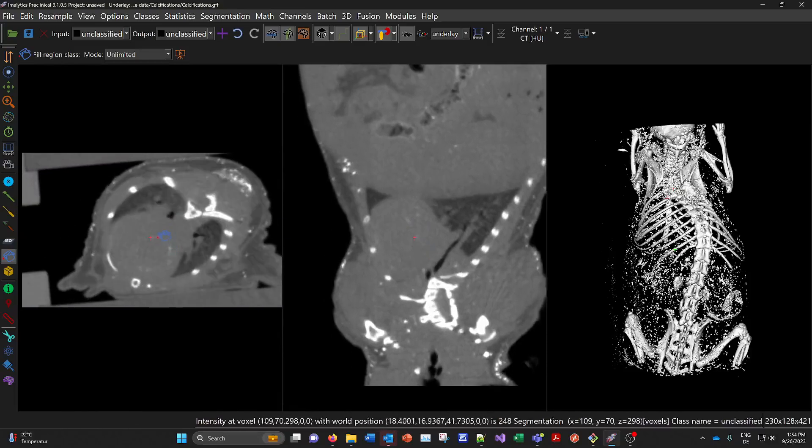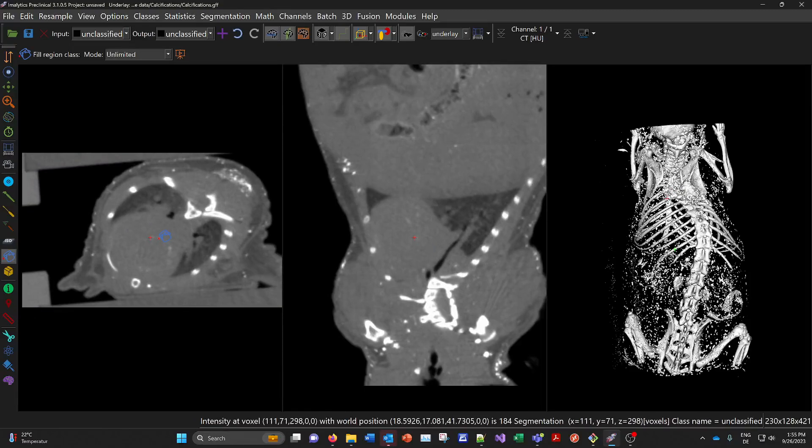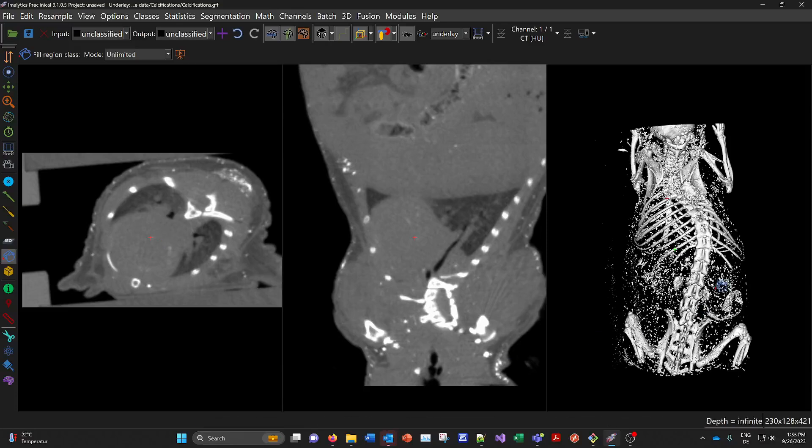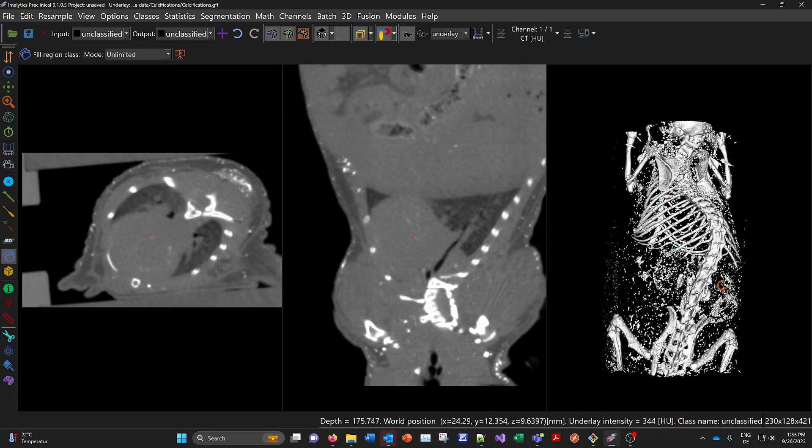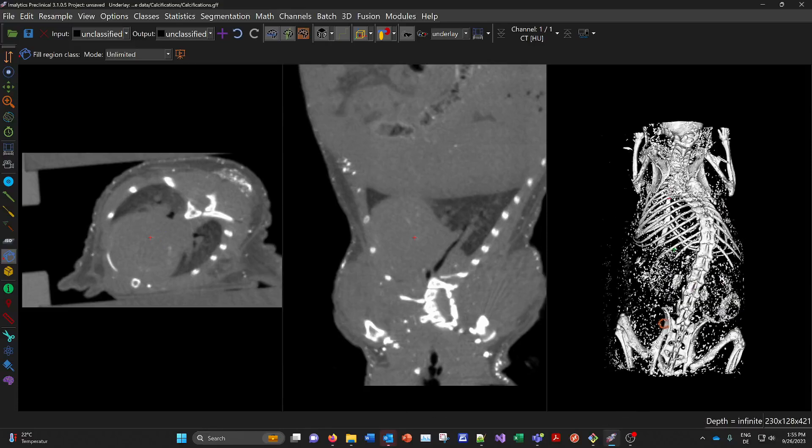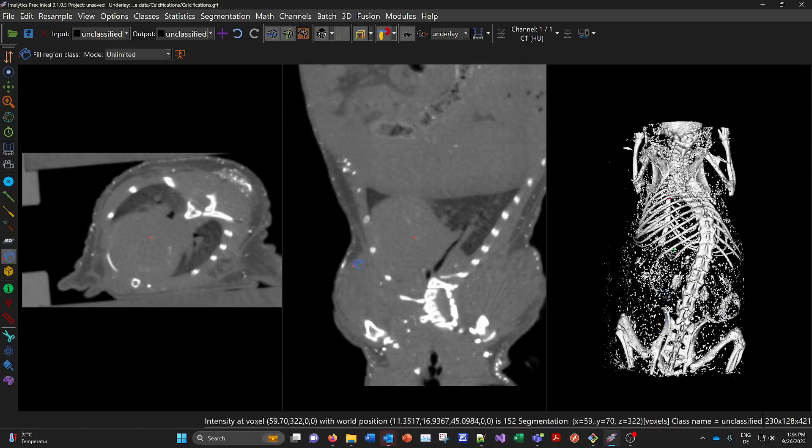A lot of calcifications. And this mouse model is a knockout mouse and it has a deficiency with some proteins which regulate the calcium in the blood. And that's why it's getting a lot of calcifications here.